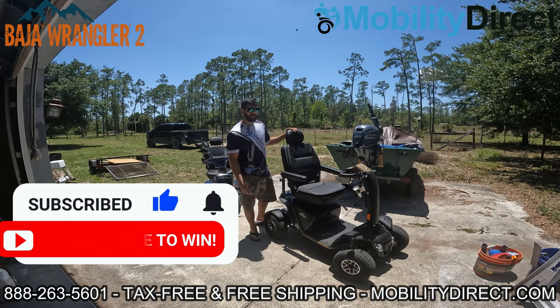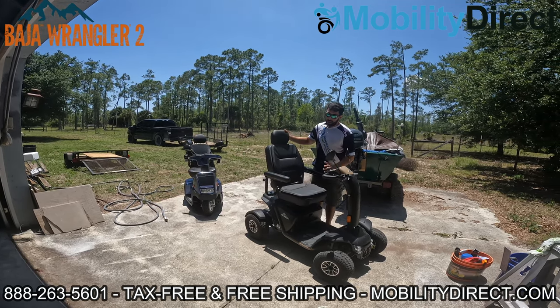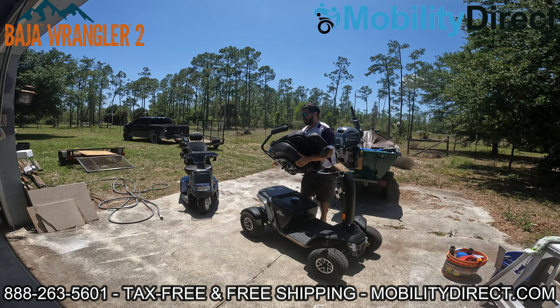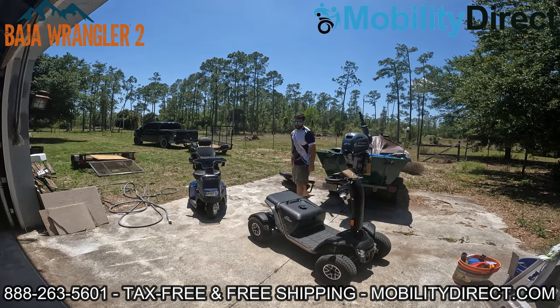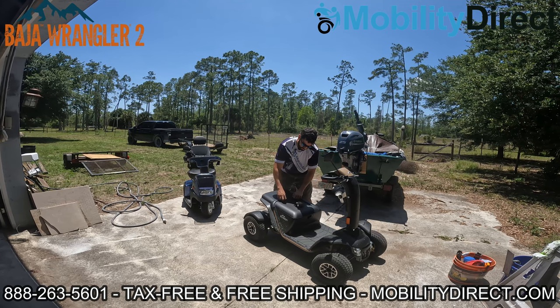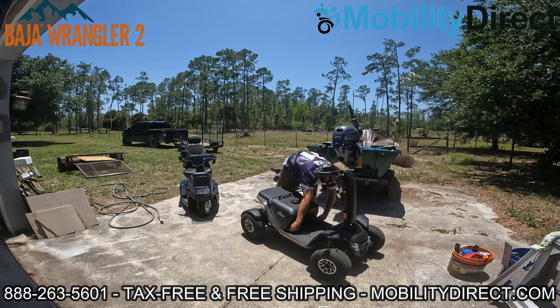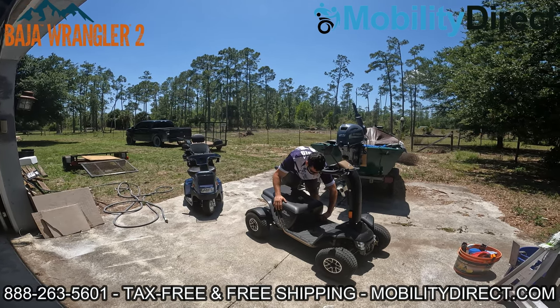We're going to show you how to wash this thing properly without ruining the scooter. Mobility scooters are not waterproof — they are rain-resistant, but not waterproof. So what I'm going to do is take the seat off first and put it to the side. I want to get it far away because I am going to be spraying some water, and it's important to disconnect the batteries.